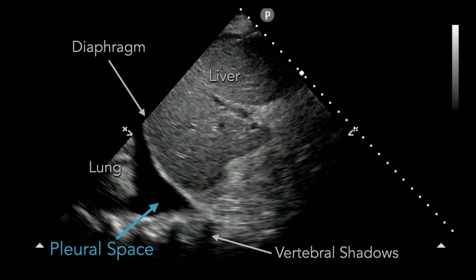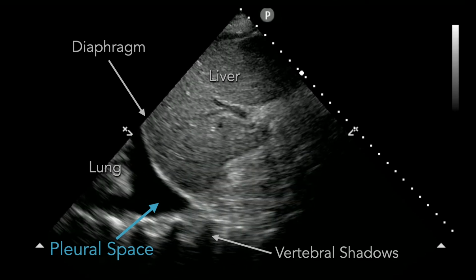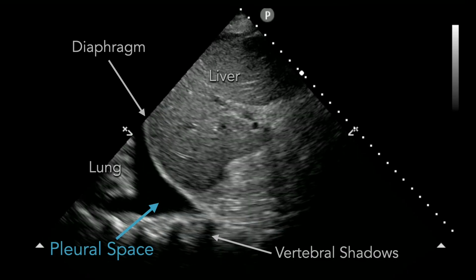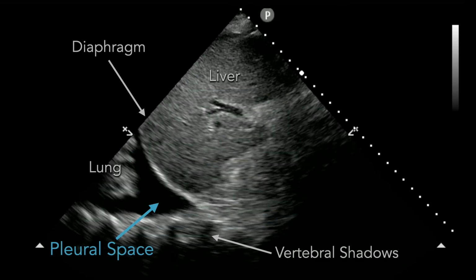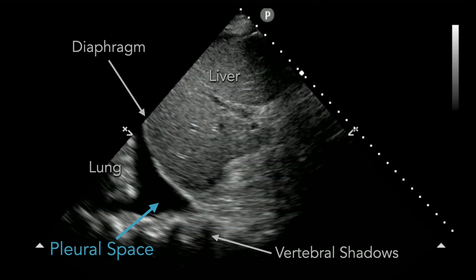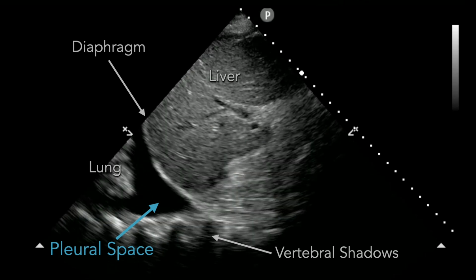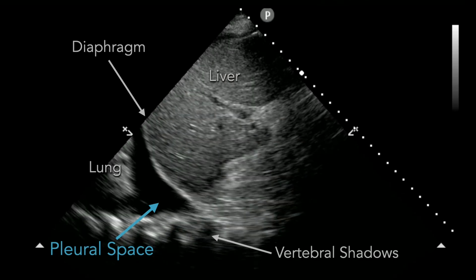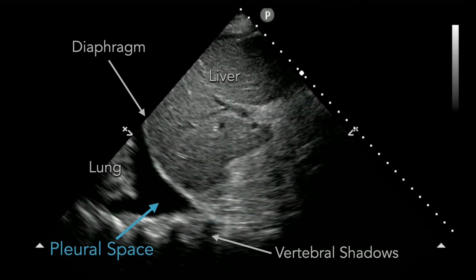And sometimes, particularly in the spleen, when you have subphrenic fluid, that fluid can peel that diaphragm away from the spleen or push the spleen down from the diaphragm. And so you have to be really careful that there's not a second line a little bit further up, that you'd positively identify that bright white line as the diaphragm, right? So that's the key, identifying the diaphragm, right?